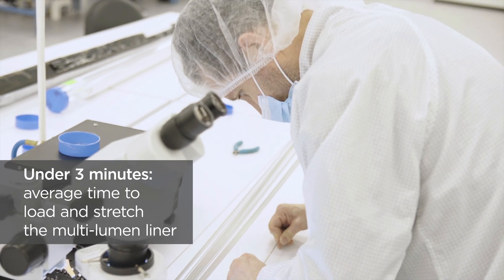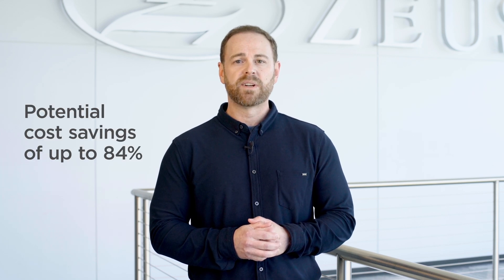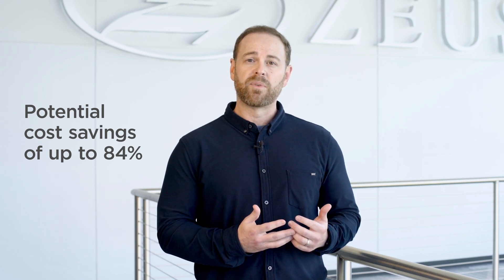For manufacturers using our multi-lumen liner versus a traditional assembly process, we calculated the potential cost savings of up to 84%. There's potential for even more savings when you factor in things like a simplified bill of materials, reduced operator training, and other efficiencies.